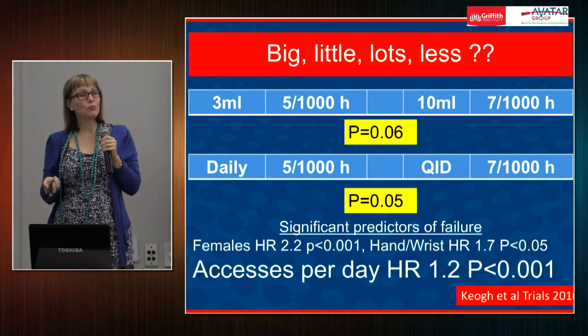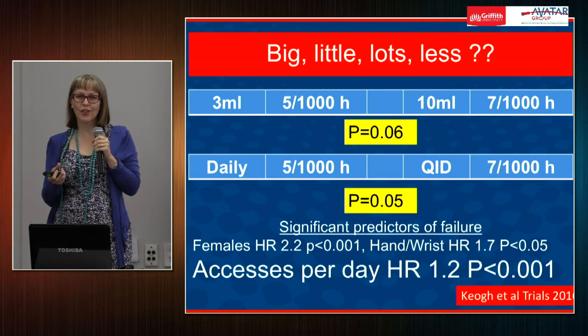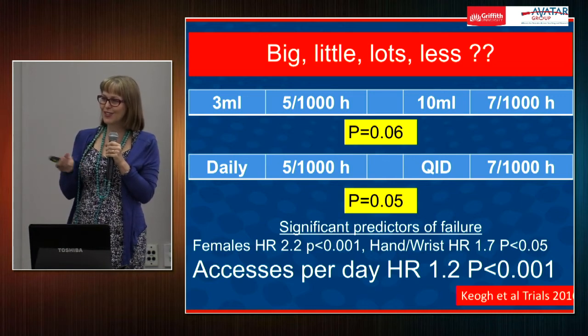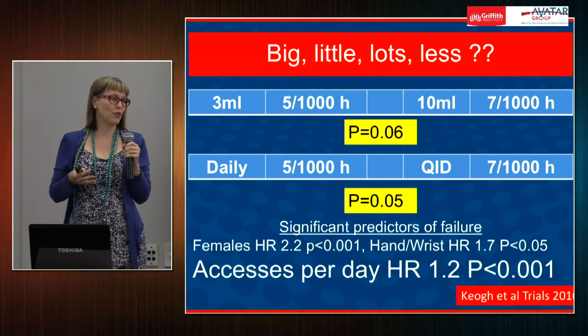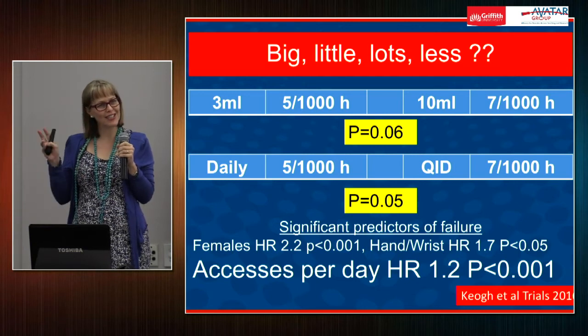Now, maybe it's what we're putting through the devices, of course. Now, how we dilute our medications comes from those manuals. Who wrote those? Did God write those? Did Noah? Are they based on randomized trials of 100 mils versus 50 mils over 30 minutes? No, they're based on good, physiological, theoretical evidence, usually from our pharmacy colleagues. And we're grateful to have them, but we've very rarely actually tested them.